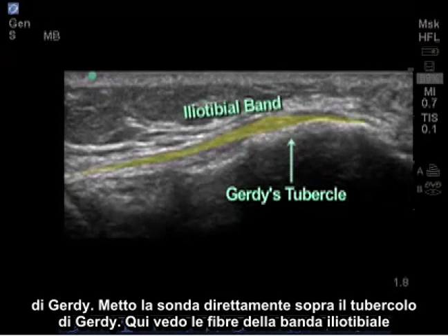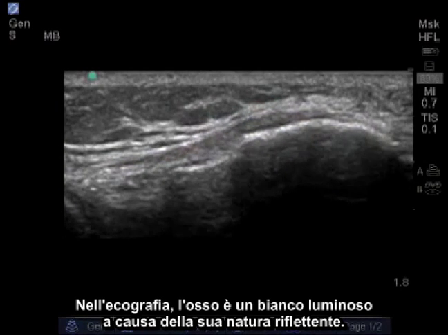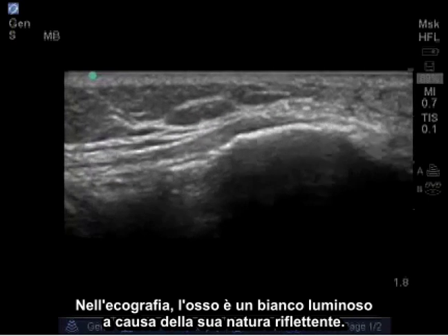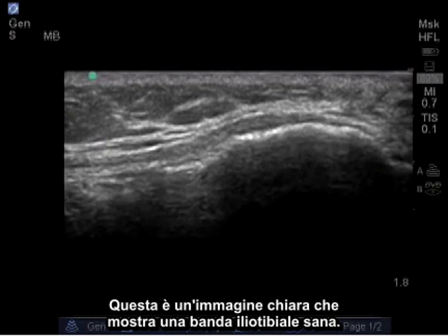Here, I see the fibers of the iliotibial band attaching on Gerdy's tubercle. In ultrasound, bone is bright white due to its reflective nature. This is a clear image showing a healthy iliotibial band.